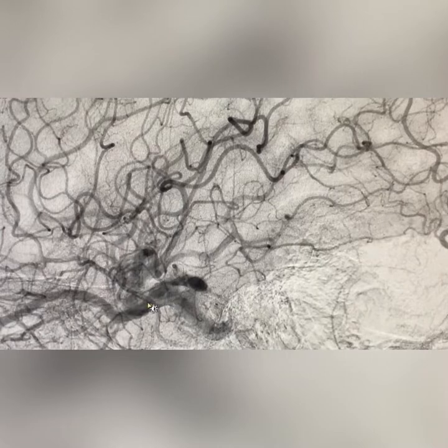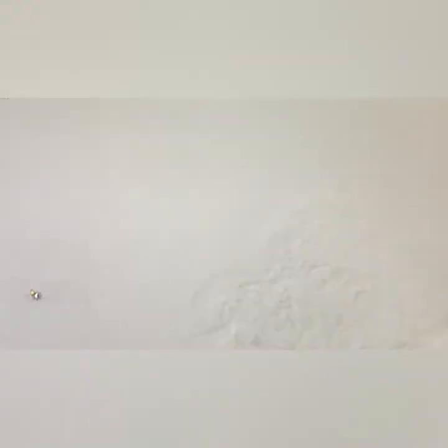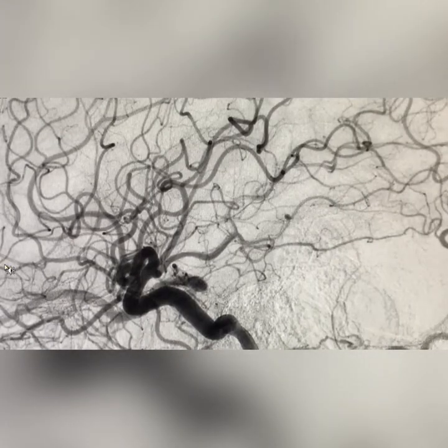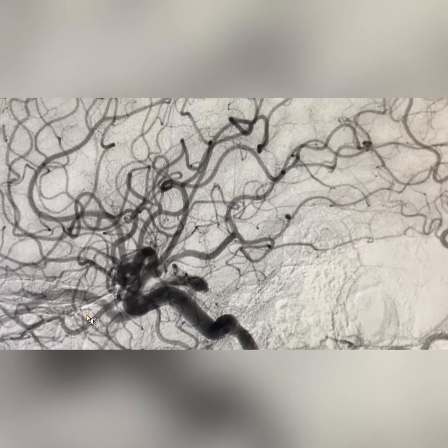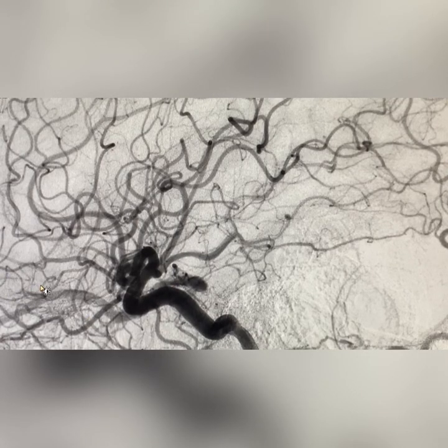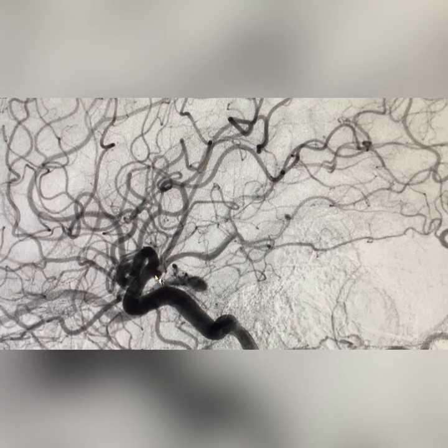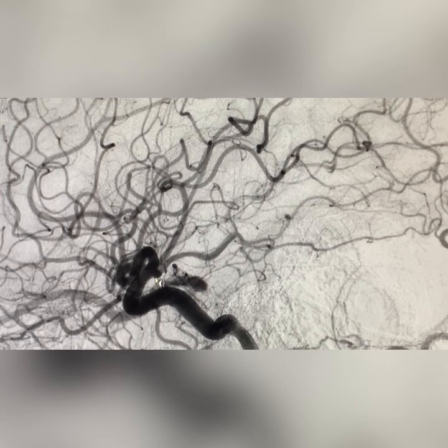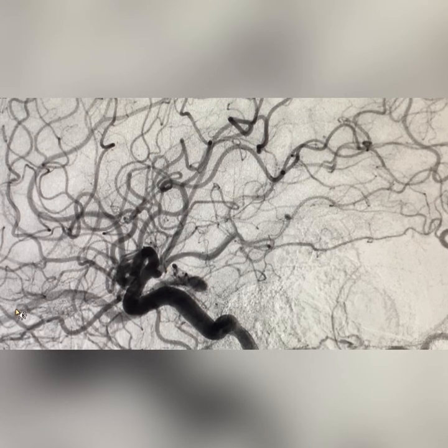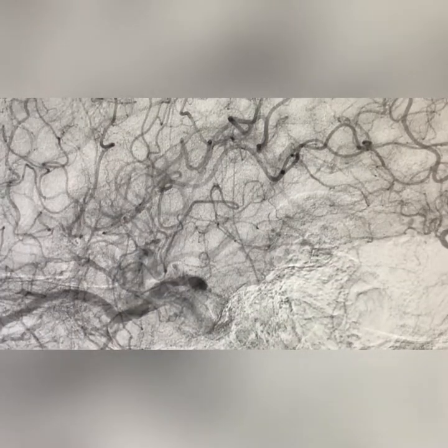The early opacification seen is the cavernous sinus, and there is also opacification of the superior ophthalmic vein. This superior ophthalmic vein, which was otherwise responsible for draining the eyes, is now under tremendous pressure. Instead of draining from the eye toward the cavernous sinus, there is a reversal of flow — the elevated cavernous sinus pressure is pushing blood into the superior ophthalmic vein. That is the reason for the patient's proptosis and congestion.